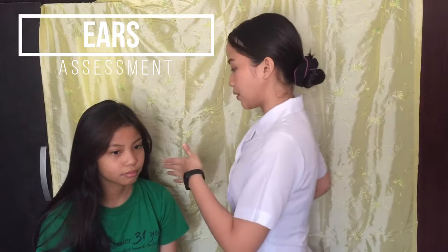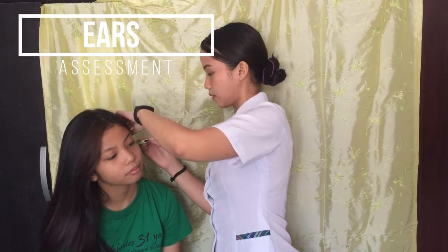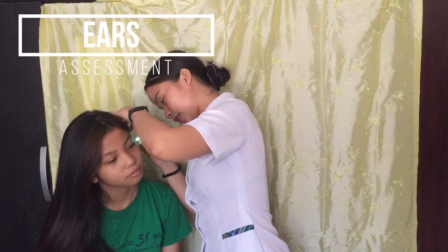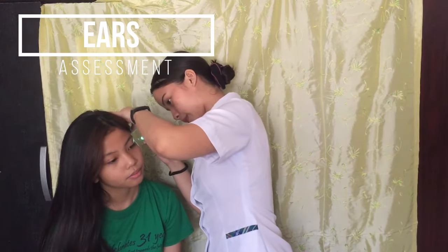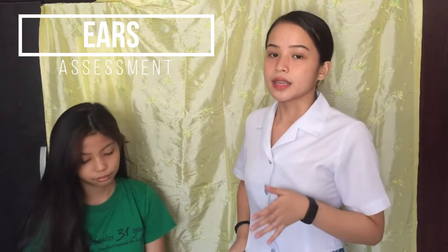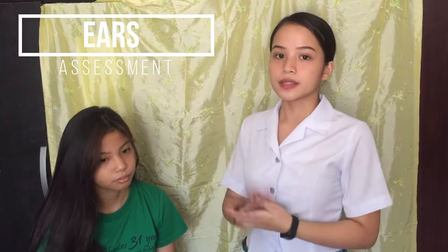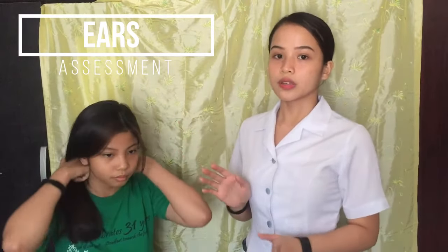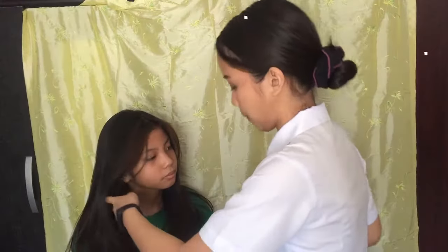So I'm gonna touch your ear, okay? Up and back. Do you feel any pain as I'm pulling your ear? No. So patient's ear canal is the same color as the ear, and there are no foreign bodies. There is cerumen or wax, which is totally normal for the patient. So we're gonna proceed to the other side.